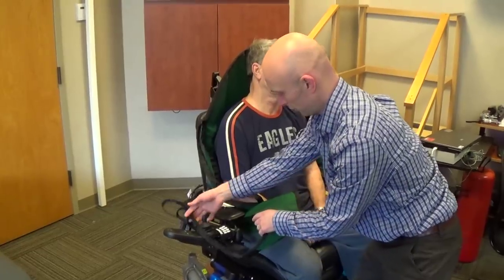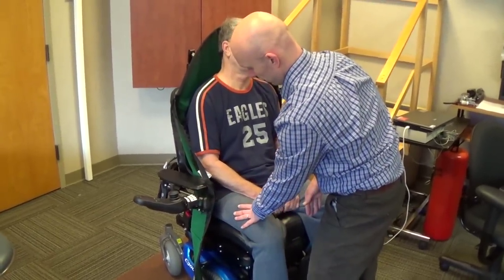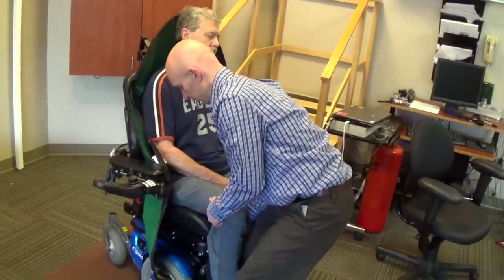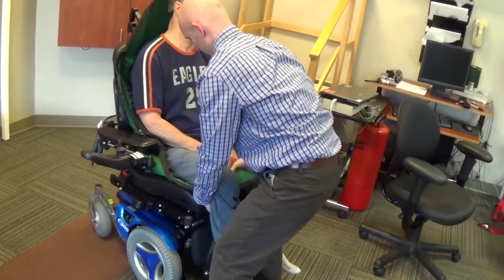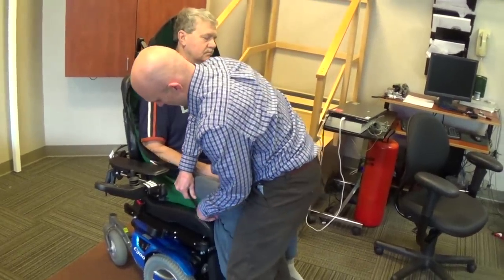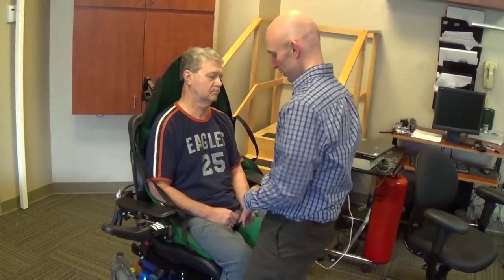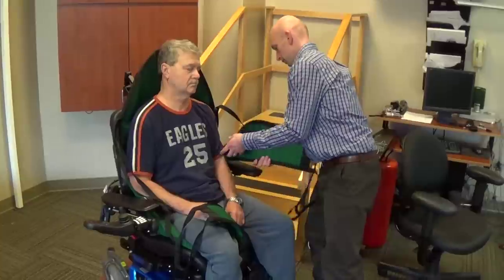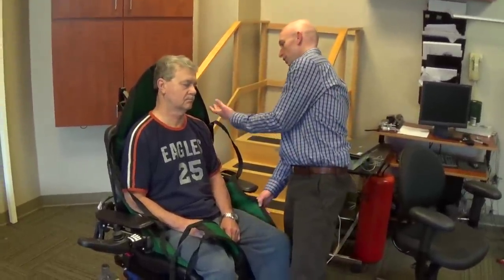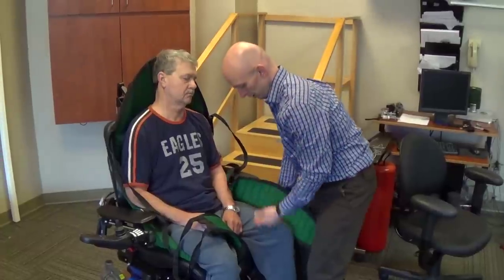With the leg loops, trying to make sure there are no twists as you place it under the person's leg. Lifting the leg up, and then pulling the leg strap through. The higher you can get the leg strap up, the less the person will slide through the hole that's created by the divided leg sling. We'll just go on the other side. If the person has poor trunk control, you can also have the wheelchair tilted posteriorly so their back is weighted.